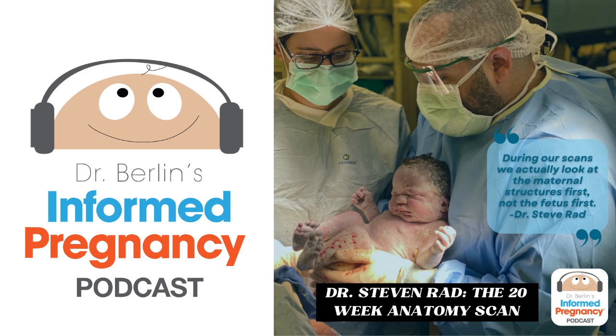I'm not sure if someone's figured out a way to use it, unless you're looking at like a tumor maybe or some structure and you want to see how it's all connected. You're trying to figure out, map something out. Maybe the 4D can help you, but it's mostly a keepsake kind of ultrasound.